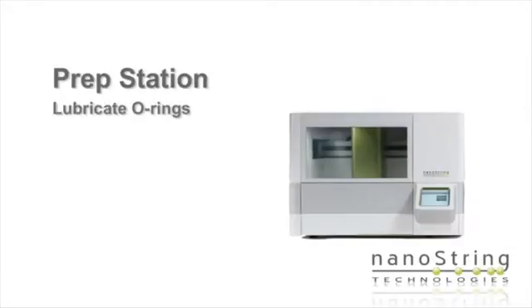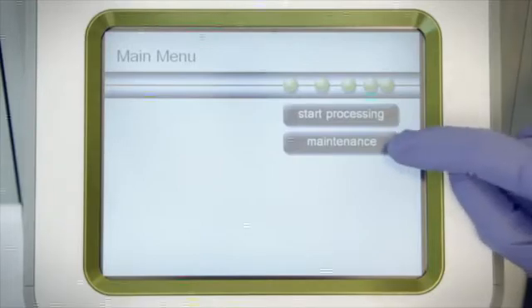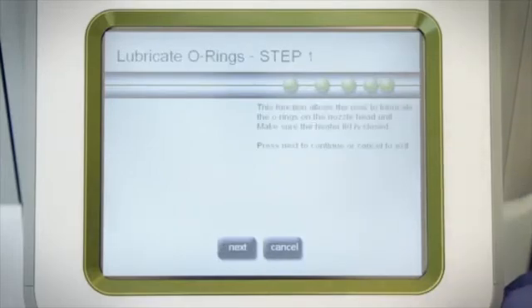The prep station requires periodic lubrication of the O-rings. The prep station contains an internal timer which sends a reminder every 2 weeks that the O-rings need to be lubricated. This reminder is a yellow icon that appears to the left of the Start Processing button if the O-rings have not been lubricated in the last 2 weeks. To lubricate the O-rings, go to Maintenance, Hardware, Lubricate O-rings, and follow the instructions on the screen.